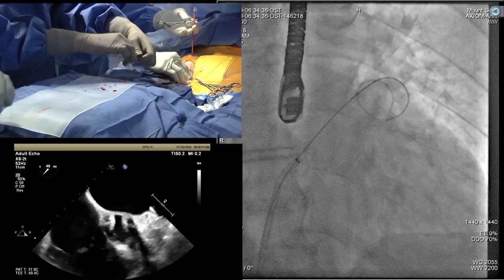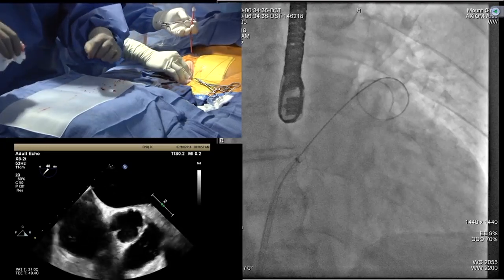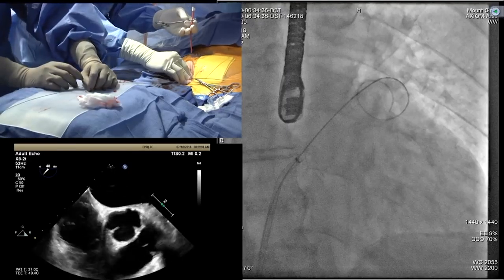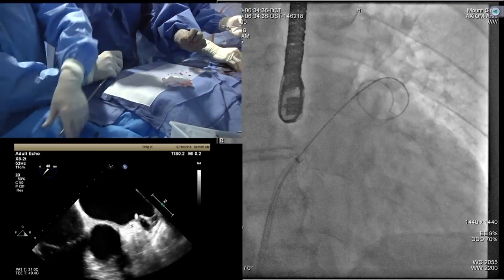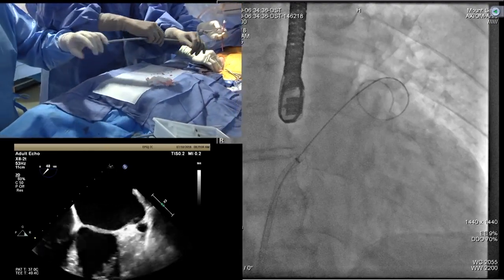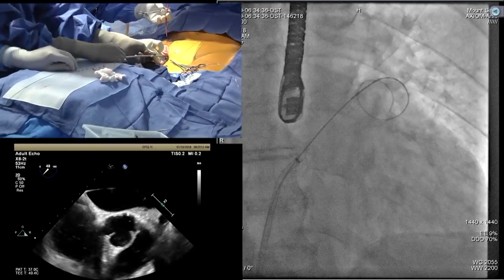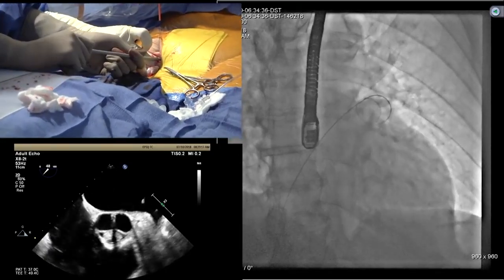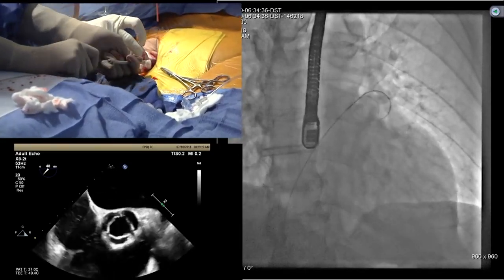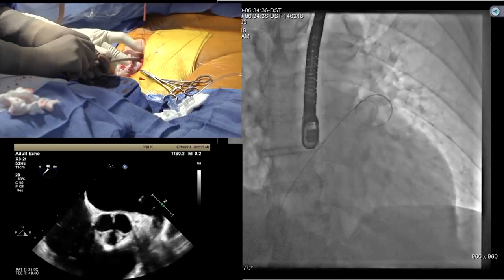Good. Now get us the steerable guide. Now very important, we have to dilate first. So the guide is a 22 French, so we are going with a 14 French dilator. So dilate the vein as well as the tissue in the groin, making sure you're right. Guide is okay there. Yeah, wire. This is 18. Do you need a bigger? No, the skin nick. No, it's good. Go, go.